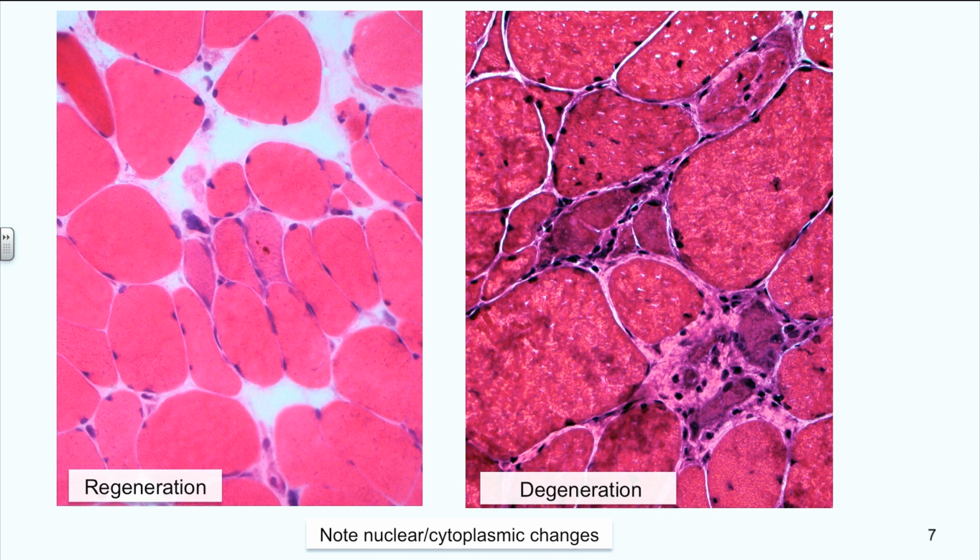And the increased scar in the endomysium, meaning in between the myofibers, shows that this muscle has suffered from this disease for a long time and is gradually losing its capacity for regeneration.